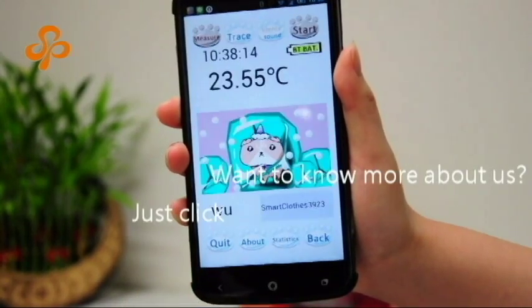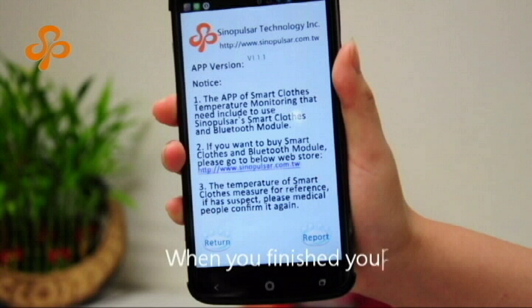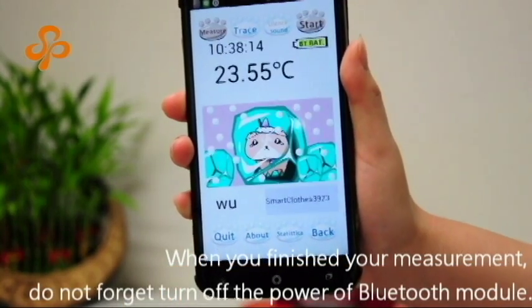Want to know more about us? Just click the information, then it will show the name of our company and where you can buy products. When you finish your measurement, do not forget to turn off the power of the Bluetooth module.